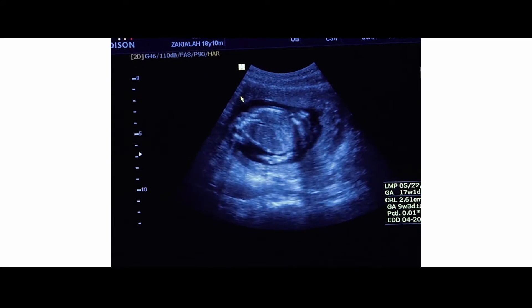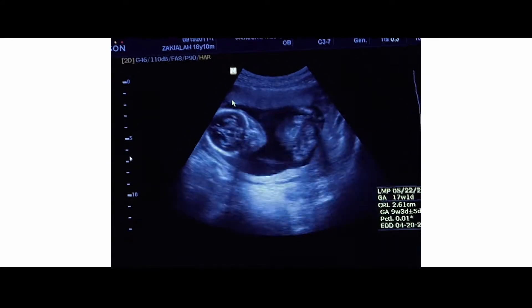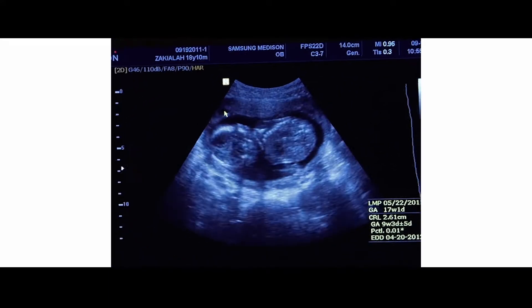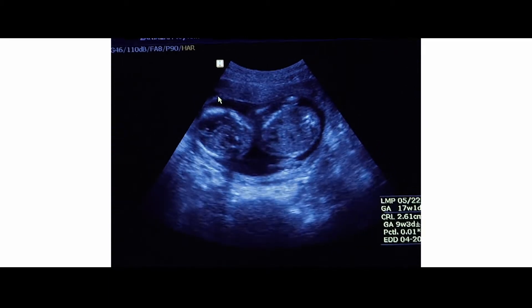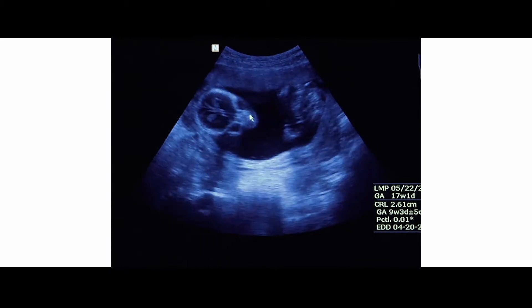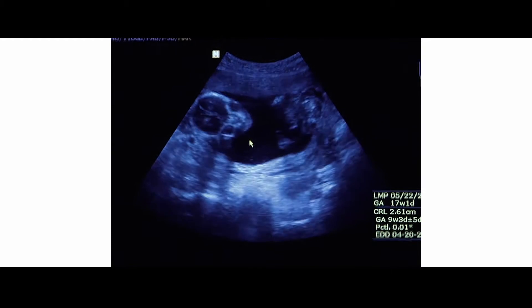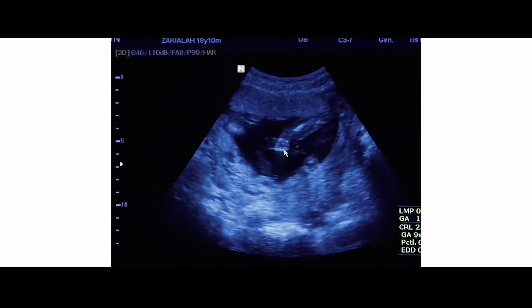Here's the bladder, here's the vaginal canal, and this is the placenta right here. Now we've got part of baby. To find the rest of baby we're going to turn and rock and stretch them out — that's how the baby's lying right now, transverse almost, with the head over here which is mom's right. If I angle up toward mom's head we see the spine, and here are the ribs. There's the face, the eyes, and the mouth, and these are the little arms — there's a hand.